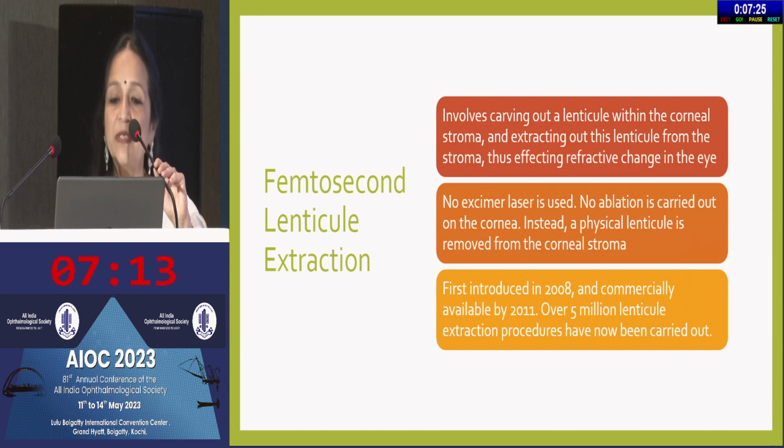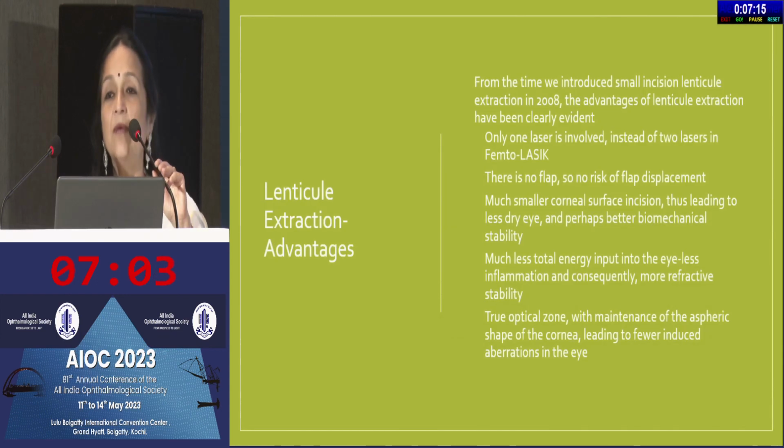It was first introduced in 2008 and commercially available by 2011. In the last decade, over 5 million lenticule extraction procedures have been carried out, which says a lot about itself.